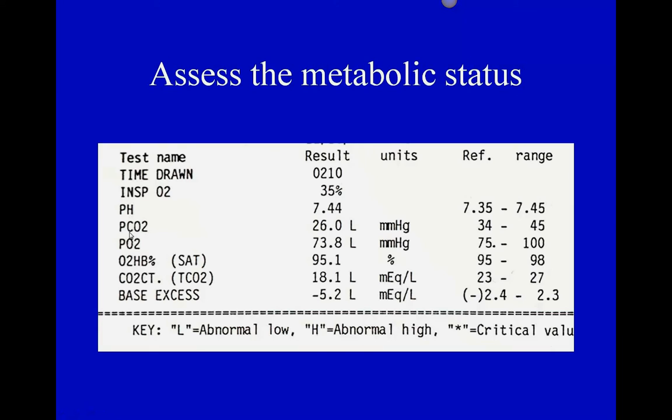So let's look at this person's bicarb. Well, this lab reported as total CO2. This is the normal range we're going to use, 23 to 27, because we're using total CO2. If we're lower than that, the pH moves in a downward direction too. And when pH moves downward, we get an acid. So this is a metabolic acidosis. We'd expect then, if the bicarb's low, we're going to have a base deficit. And we do. We are short a certain amount of bicarb.